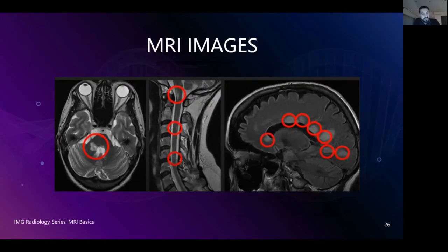And in this particular image, the first one on the left side is a T2 image, and we're looking at a FLAIR image on the right side, enhancing the intensity of those particular lesions to see them a little bit more clearly.